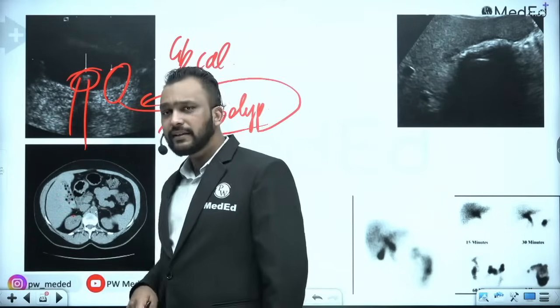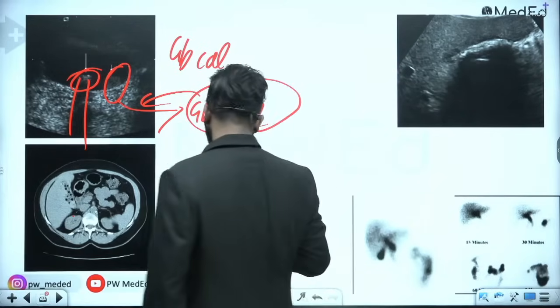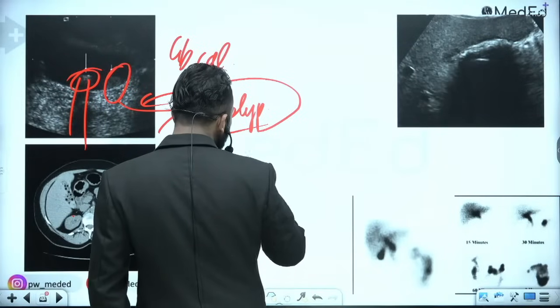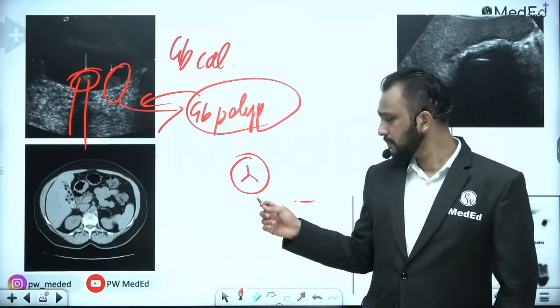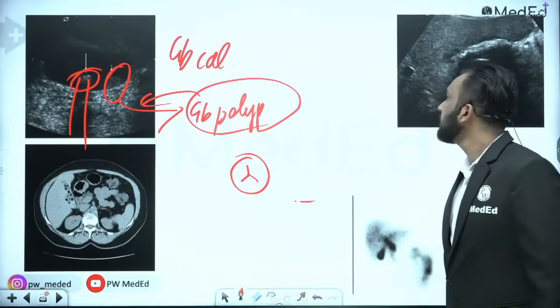And if you look at the CT images of these patients, sometimes they can be radiolucent also, and sometimes because of the presence of nitrogen bubbles they can give the appearance of your dream car, that is, your Mercedes-Benz sign can be seen.